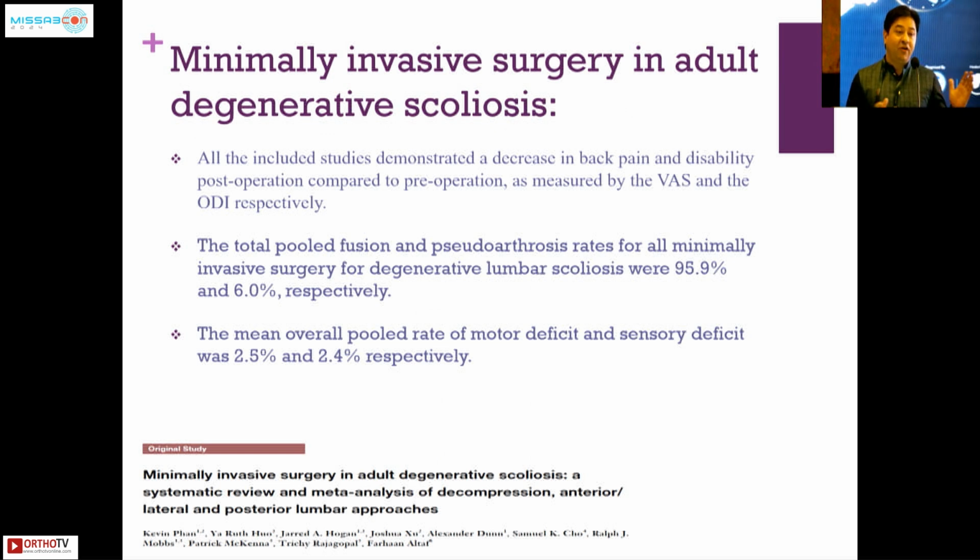So now we have all talked about how to do it. Let's see what are the limitations and what are the benefits of circumferential MIS in treating these cases. So there is enough evidence now. I think most of the guys who are sitting here, and that's why you are sitting here, are convinced by the very fact that circumferential MIS does work, and there is a lot of evidence, and not only that, it says that this is a safer approach. Even if you look at the outcomes of this approach, the outcomes are good, or at least at best comparable to any other outcome of open surgery.